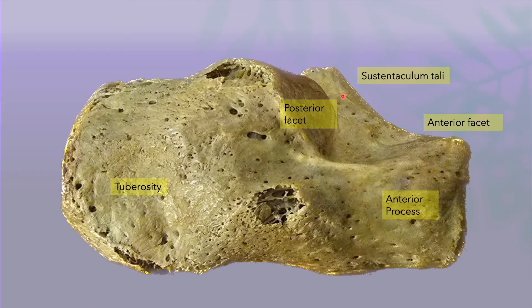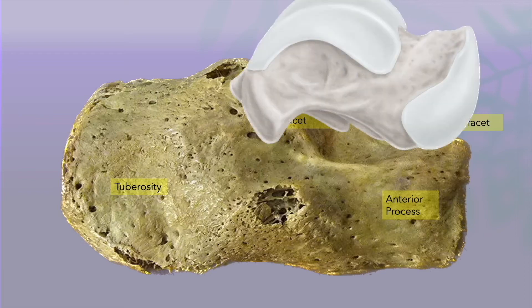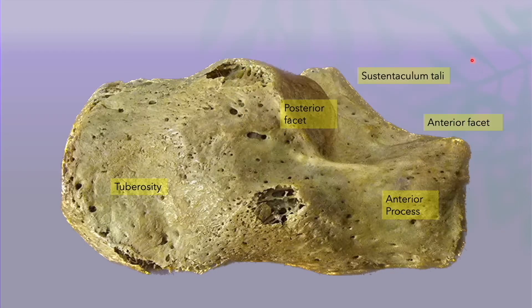On the medial side, this part is the sustentaculum tali. The anteromedial part of the talar head articulates with the sustentaculum tali. This is the anterior facet. The lower part of the talar head rests on this part. The talus is the curved bone. The major part of the talar undersurface articulates with the posterior facet. The anteromedial part articulates with the sustentaculum tali, and the inferomedial part of the talar head articulates with the anterior facet.